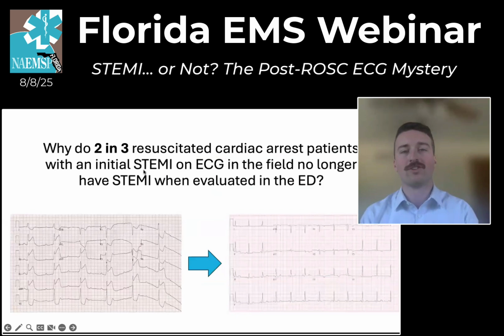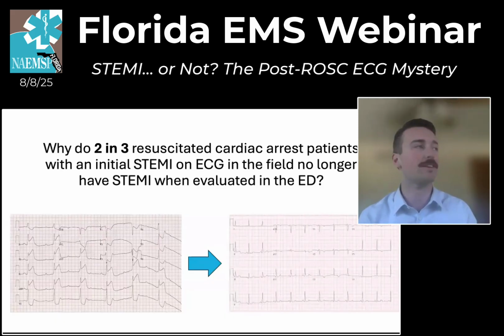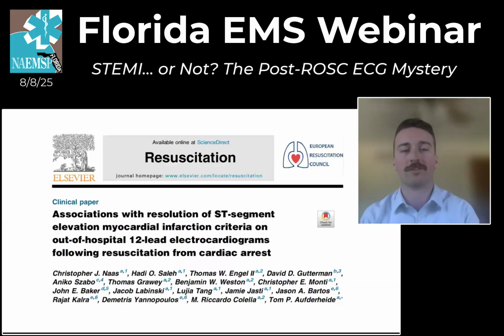So the fundamental question here is why is it that 2 out of 3 resuscitated cardiac arrest patients with an initial STEMI no longer have that STEMI when we do a repeat EKG in the 12 lead? And what does this mean for our decisions to mobilize the cath lab and to really inform the patient's post-resuscitation care when they get to the hospital? What role do EMS 12 leads really have in this context? So that was ultimately what informed our subsequent paper.